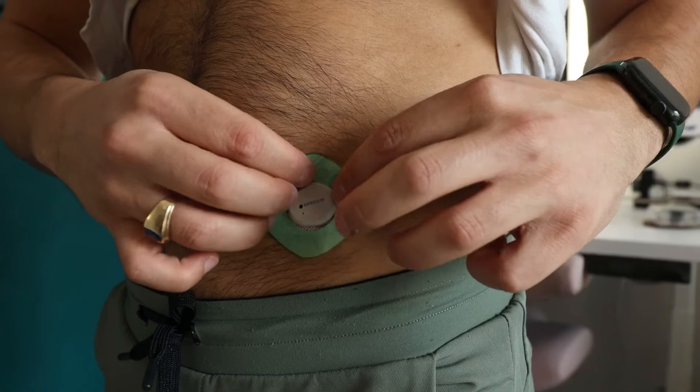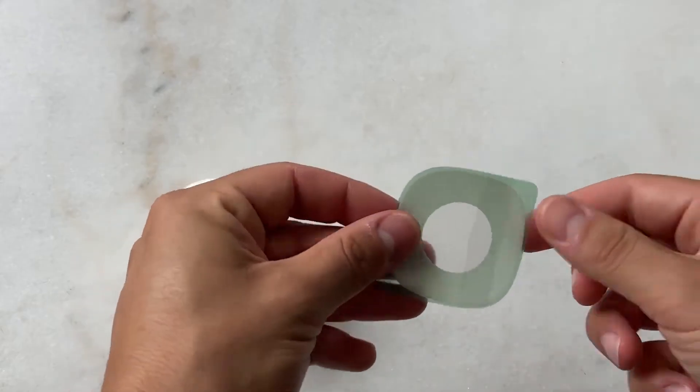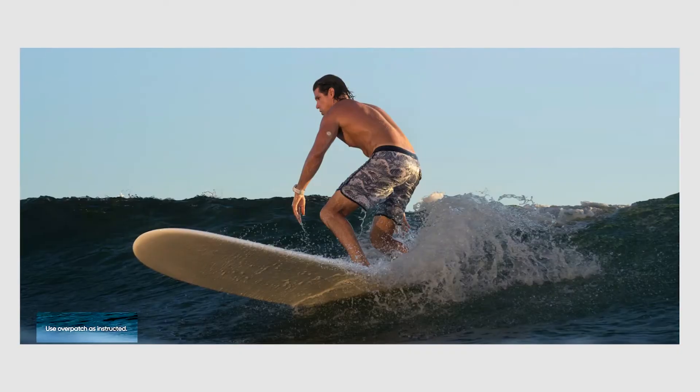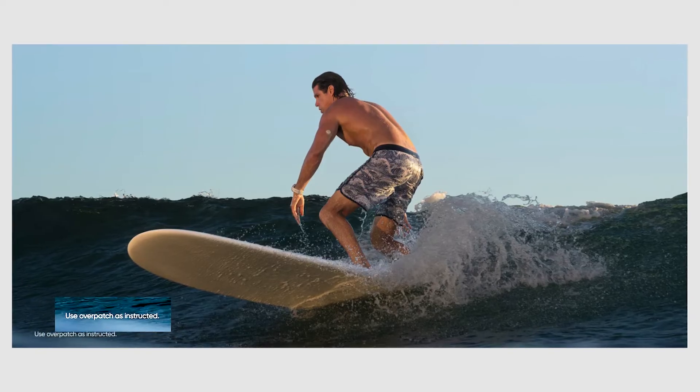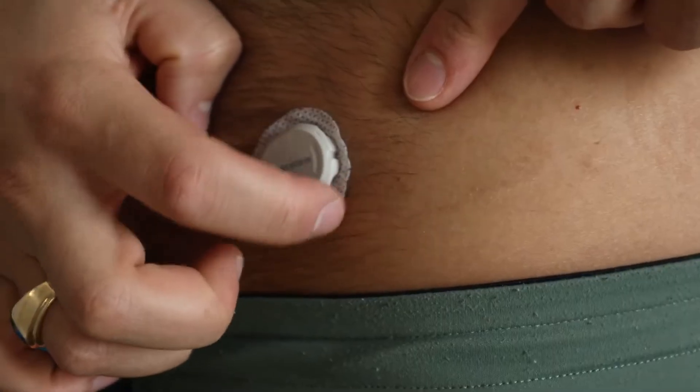For me, it stays on the full 10 days without the included overlay patch. Dexcom says that patch is mandatory to use, but I don't use it and I don't need it. Everyone's skin is different though. I work out three to five days a week, I sweat, and I went swimming a fair amount this summer and it stayed on. Maybe by day eight it started coming off along the edges, but I'd say 90% of the time my Dexcom G7 stayed on the full 10 days and for the grace period.